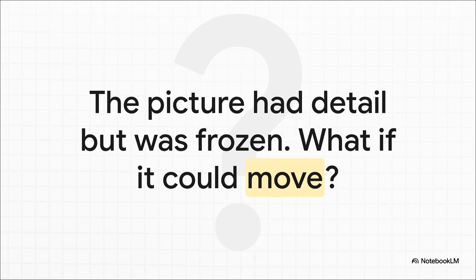I mean, just stop and think about that for a second. What if you could actually watch a heart valve fluttering open and closed in real time, or see a baby kicking inside the womb? The new goal was to turn the static photograph of ultrasound into a living, breathing movie.